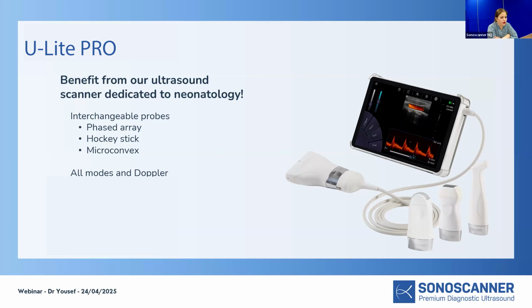And in the latest European recommendations, there are also a few lines saying that if you have the expertise, then you may use lung ultrasound to do so. Some studies have monitored the changes after surfactant therapy. You would not see immediate changes, but following the babies up, there are a number of studies having looked at that which are easily available.